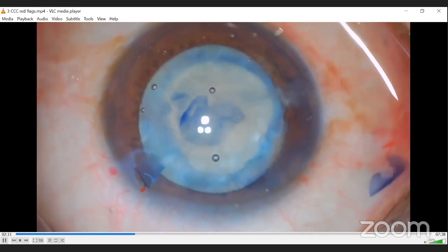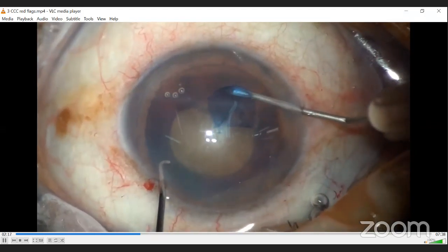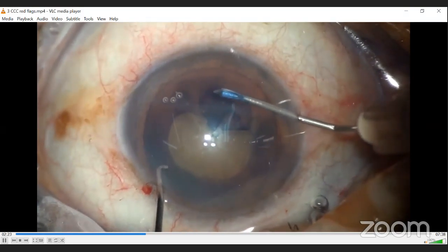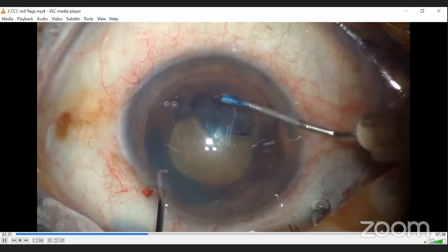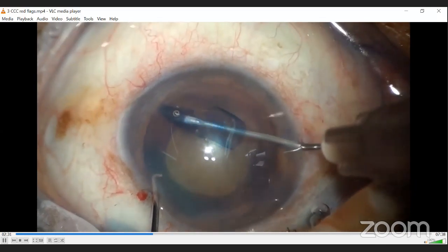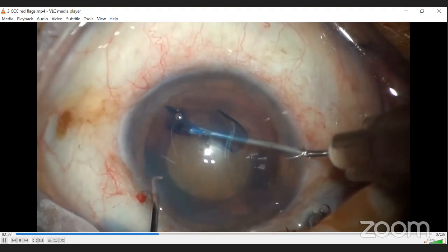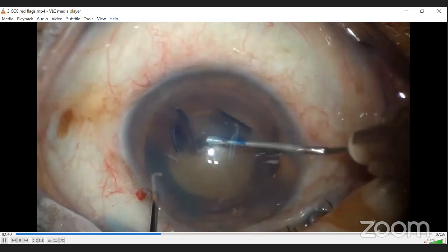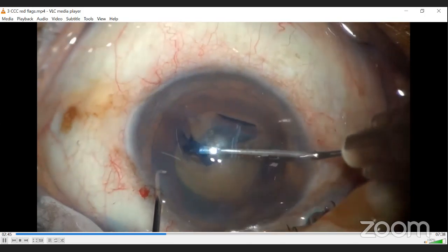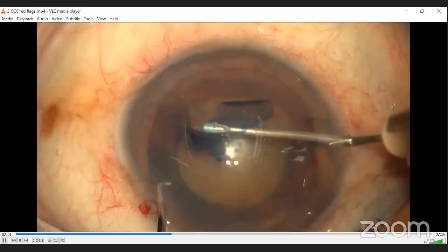Now let's look at another case. So watch here, the surgeon is very cautious. He is pushing the flap slowly, but watch how closely he's working at the edge. If you consider the rule of triangle, he's not following that. He's trying to catch the rhexis at the edge, and his tip is not very visible because the flap is covering it. So the flap is not flat on the anterior capsule. The tip is not visible, and he is touching or pulling the Capsulorhexis flap very near to the edge.